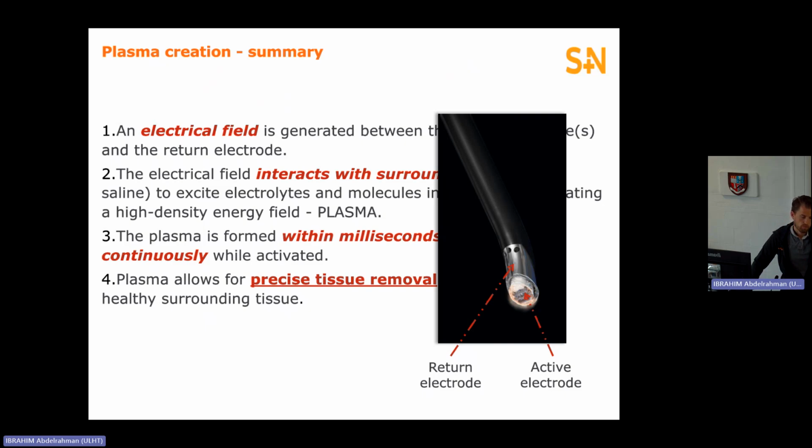When you're using it, we'll go through it later, think of it like a paintbrush almost, very light touches on and off the tissue. If you leave the tip of the wand on the tissue too long, you just extinguish the gas plasma. It doesn't allow the tip to breathe and doesn't allow you to break down tissue. So you have to come on and off the tissue to allow the plasma to reform. So when you go back onto the tissue, it breaks down the molecular bonds and sucks it away. So you've got irrigation, suction, ablation, and coagulation all in one device.